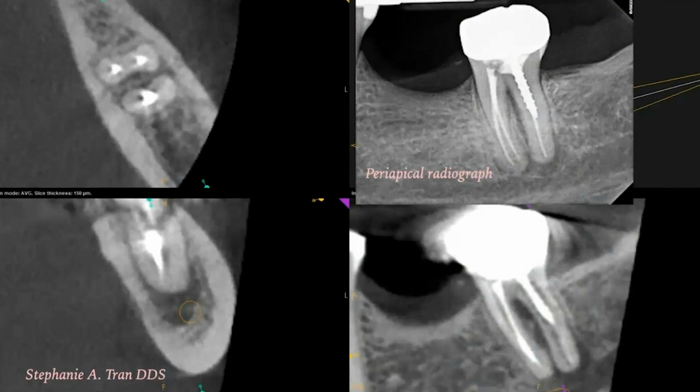We know on a 2D radiograph, such as in this two-dimensional radiograph in the upper right, that a post, because it's metallic, is going to be far more radiopaque than gutta percha. However, we can see in the corresponding CBCT image on the bottom that they both just look equally radiopaque. So these are some things to keep in mind, that reading a CBCT is not super easy. We want to make sure we're understanding how to read it and what the best settings and the best ways are to read the CBCT and to take the CBCT to set ourselves up for success.